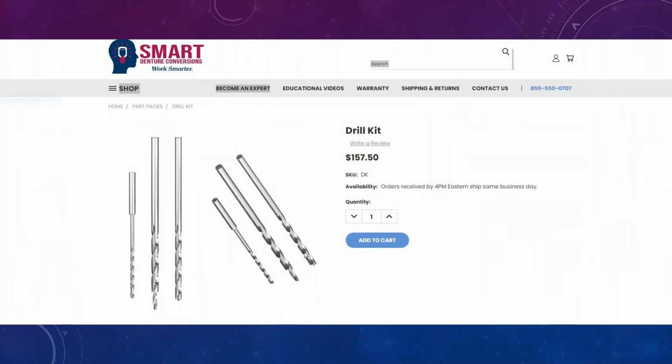Okay, why do I pre-drill my holes nowadays? Because something like this came out. I tried to make my own version of it early on, before this came out, and we had some success, but not the best. So you can buy these drill kits, and basically it has 3 drills. One goes from the implant side, and it's really thin. It goes straight to the hole of the multi-unit. The second one, you can't see it really well, is a step drill. It's got the small one here and tapers off to the large one, and then there's a large one to clean things up.